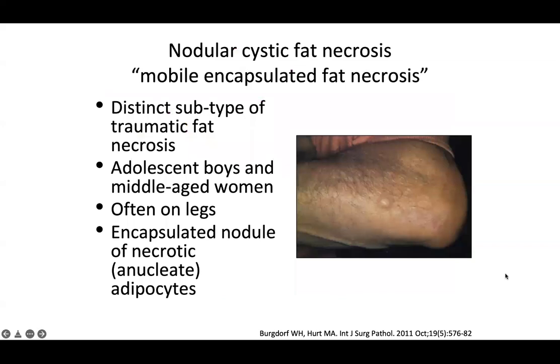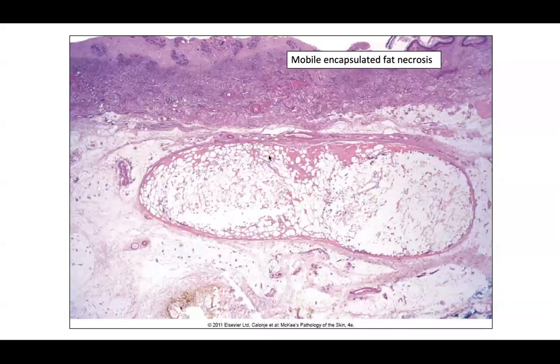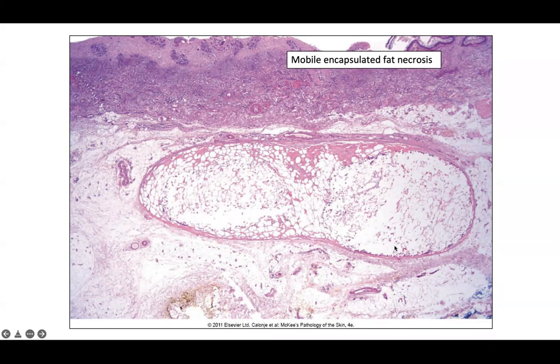Nodular cystic fat necrosis, or mobile encapsulated fat necrosis, is a distinct subtype of traumatic fat necrosis often seen in adolescent boys and middle-aged adults, more commonly women, on the legs. You see an encapsulated nodule of necrotic or anucleate adipocytes — an ovoid, elongated, encapsulated area of completely necrotic adipocytes with surrounding lymphohistiocytic inflammation in the surrounding tissue.